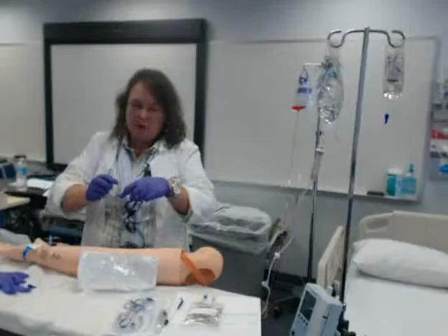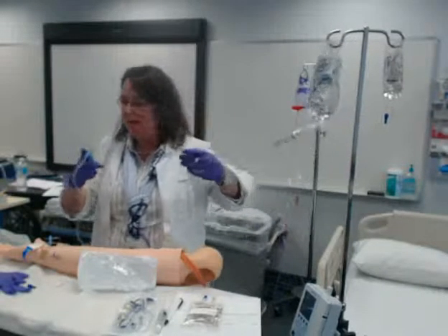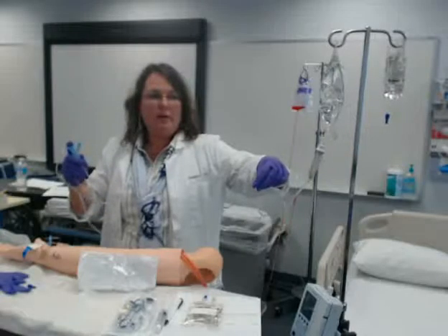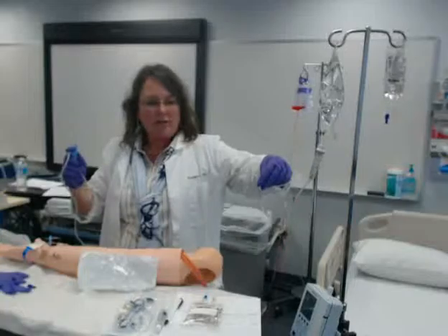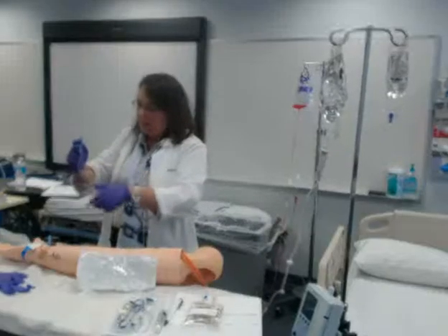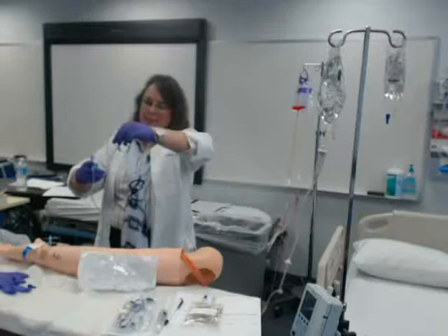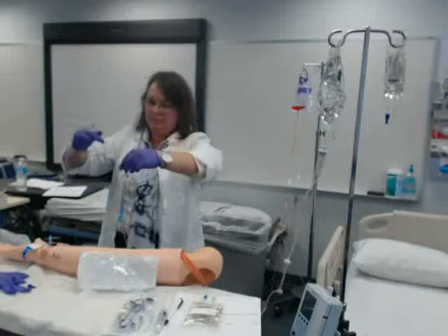Now, on my tubing, I have two ports. I have a proximal port and a distal port. The distal port — distal is always the farthest away from the patient, right? Just like the toes are distal. The proximal port would be the port closest to the patient. I'm going to hang my piggyback in the distal port. When we do IV push, we're going to do the proximal port.